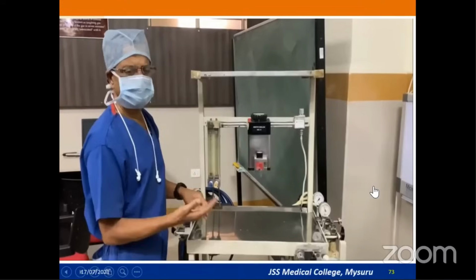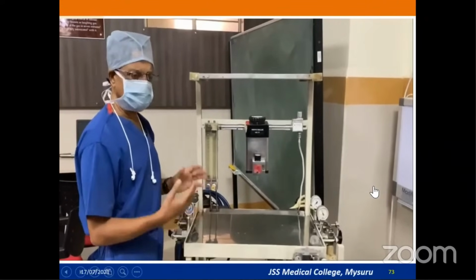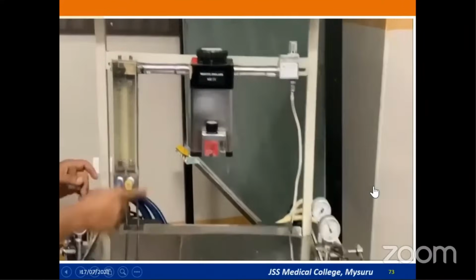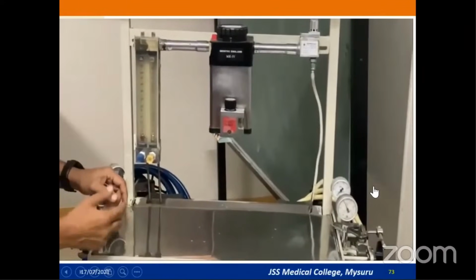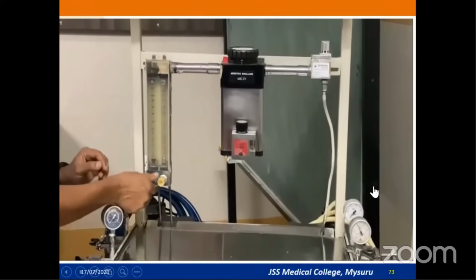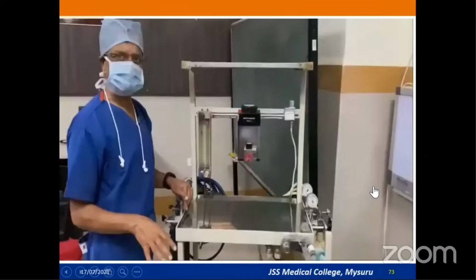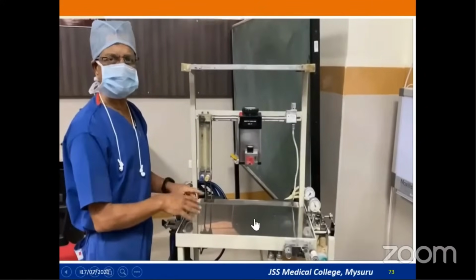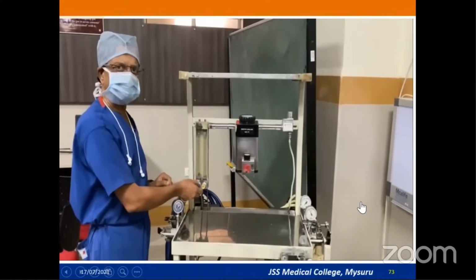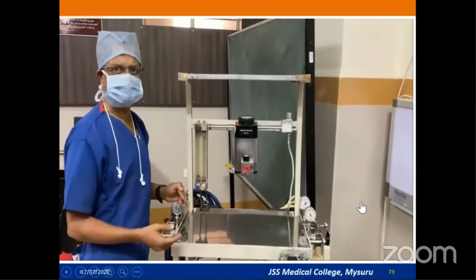The oxygen pressure has to be there to open the fail-safe valve of the nitrous oxide. But though they are called fail-safe valves, they are not actually fail-safe. I'll just demonstrate with this. So now I've opened the oxygen cylinder. Oxygen pressure is there, which is passing through the nitrous oxide regulator, and it has opened the nitrous oxide pressure regulator. With this, I can still give only nitrous oxide. See, now I have opened up only nitrous oxide. I can still give the patient only nitrous oxide without oxygen, and definitely that is going to produce quite a bit of hypoxia. So in order to prevent that, we have the proportionating devices at the flow meter level, which I am going to discuss later.